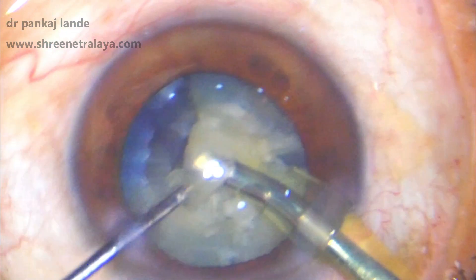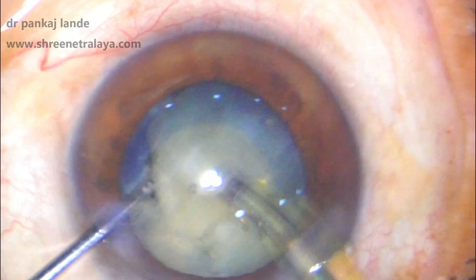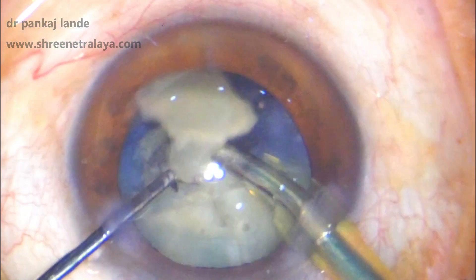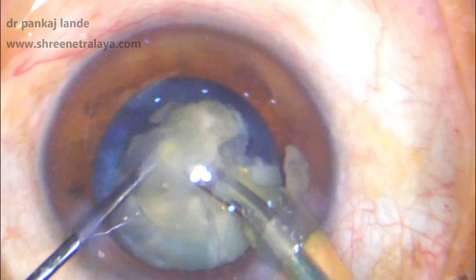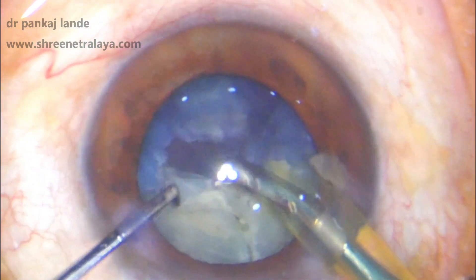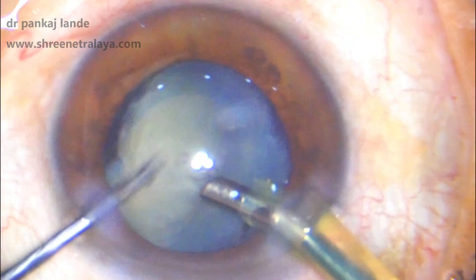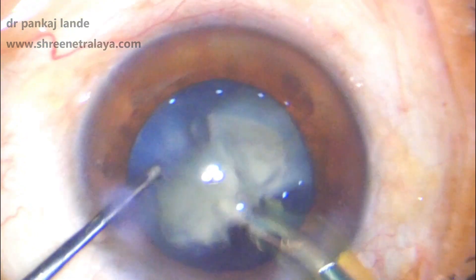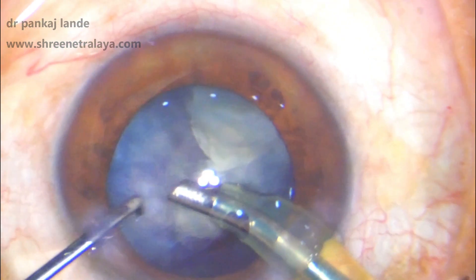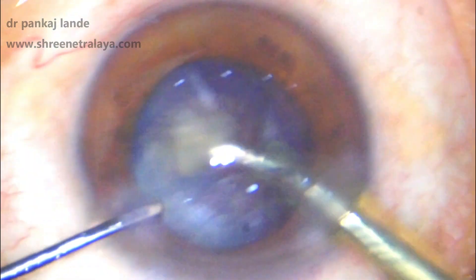Or you can proceed with making even smaller pieces and finishing each step by step. Here I have settings of phaco power 60, vacuum 350, and aspiration of 28. Each piece is taken with due care — avoid small pieces chipping, as these floating small pieces can damage the endothelium more. Keep your phaco tip in the center and let the piece come to the tip with the help of fluidics, and finish each piece separately.